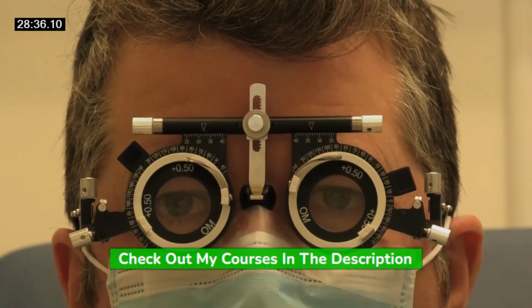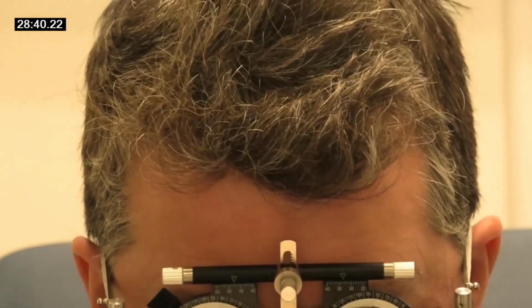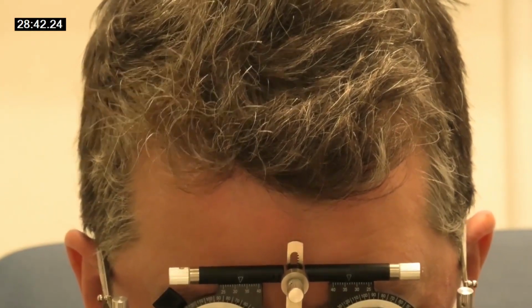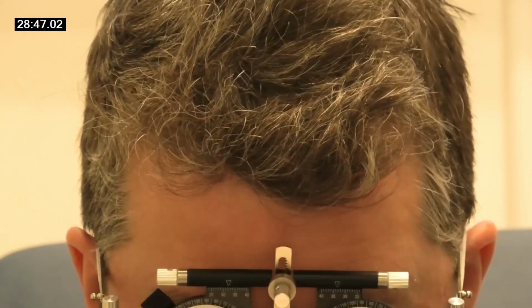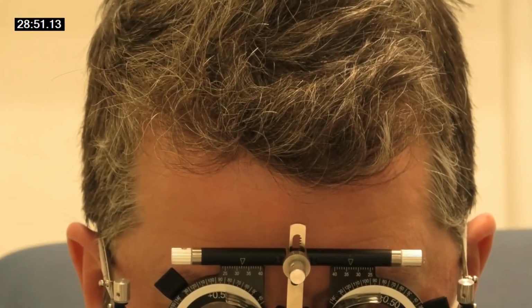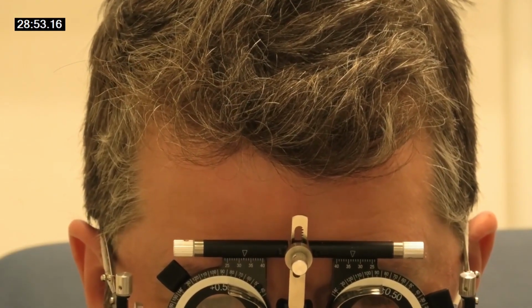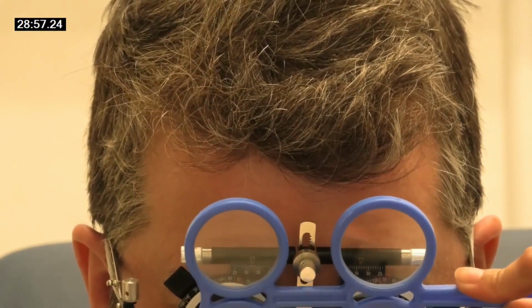Can you just hold that at a normal reading distance? Sure. And what's the smallest line that you can see there? Yeah, this very top one. And how clear would you say that is? It's very clear. Very clear? Yeah. Just going to show you some lenses just to see if we can make it clearer. Okay. Is that clear with that?